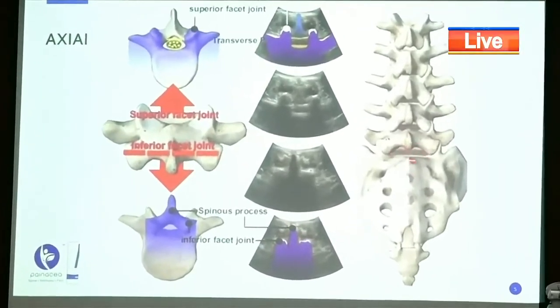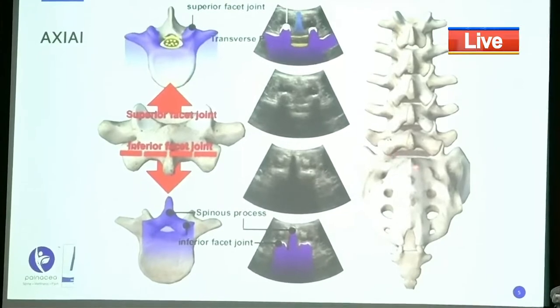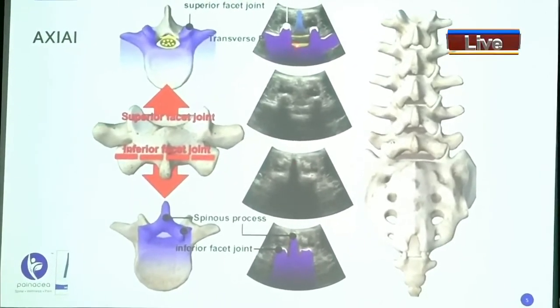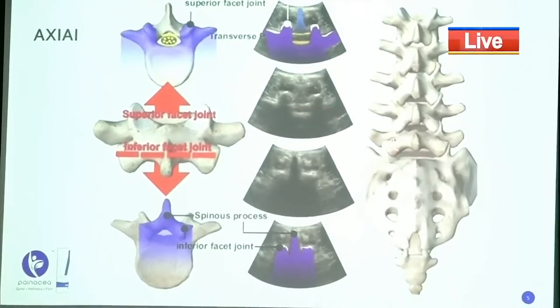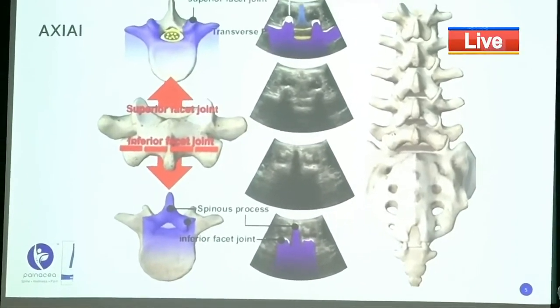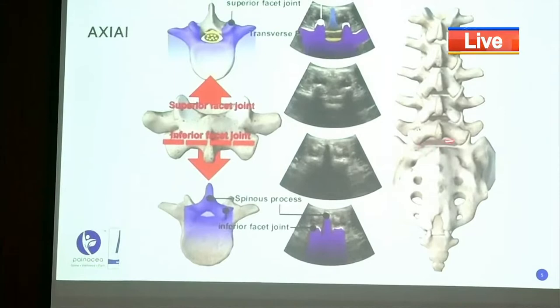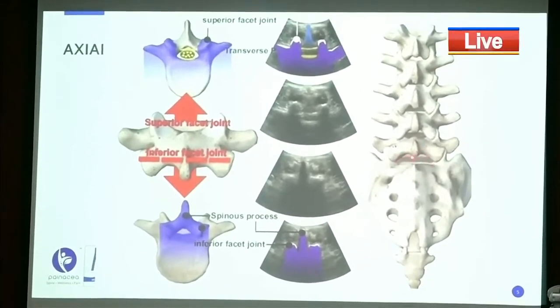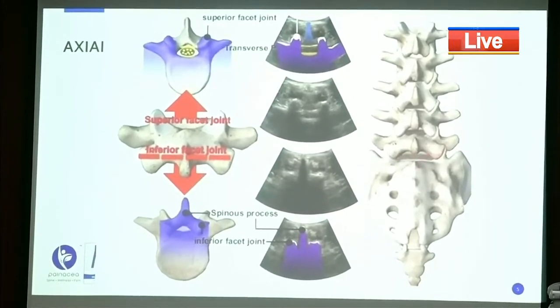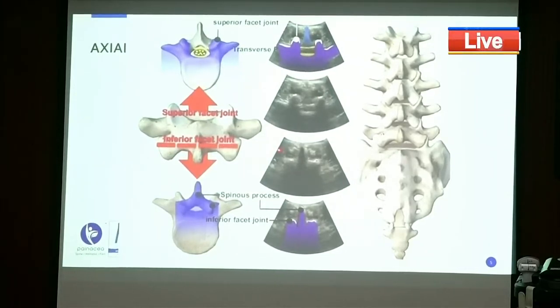Now as soon as we go up, this is the biggest hole which is there, that's the biggest window, we call it interlaminar window. It is the biggest at L5-S1. So suddenly you will find a structure which appears here. Okay, so what is this? Same your old friend. The posterior portion of the vertebral body or the anterior complex. Okay, so as soon as you see this, you are sure that now you are in this window. Okay, but now again, as I told you, who is standing in front? IAP. You cannot give your drug here because if you try to put the needle, you will inevitably hit the IAP. Okay, so you see, as soon as you go up, you first will find the IAP always.